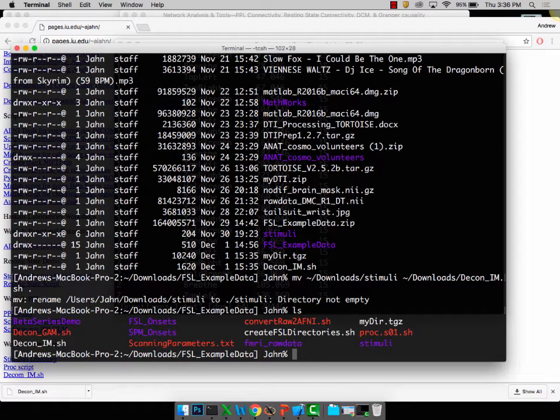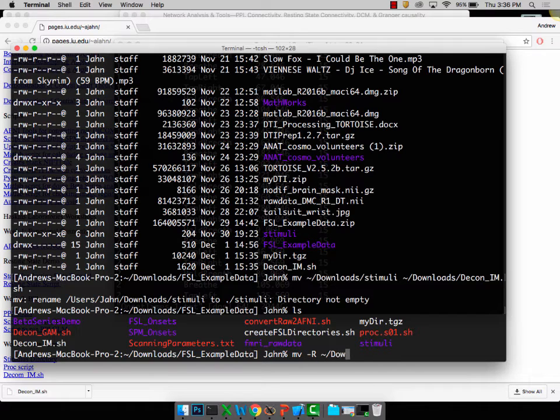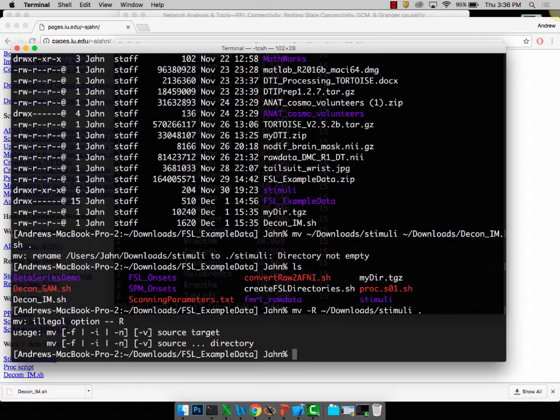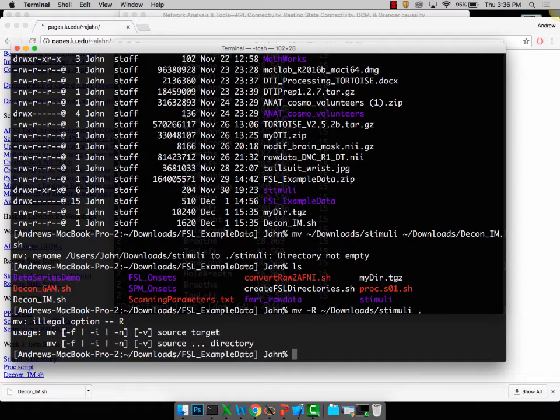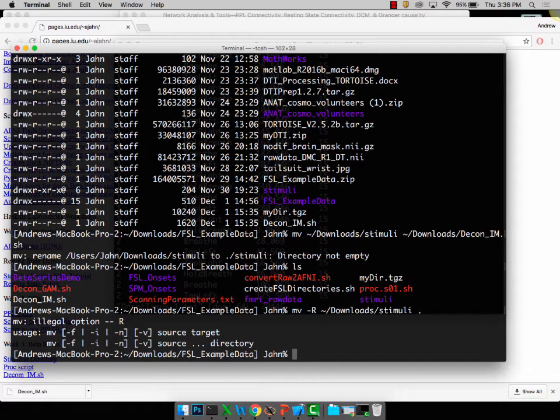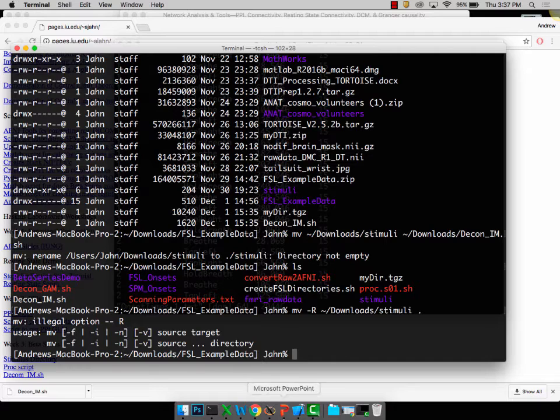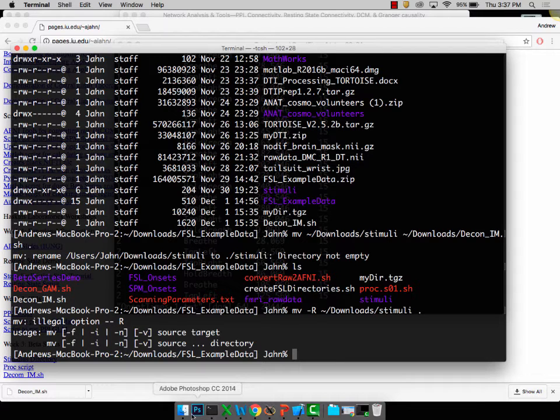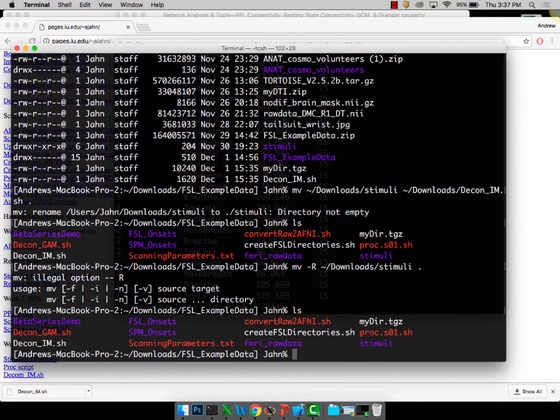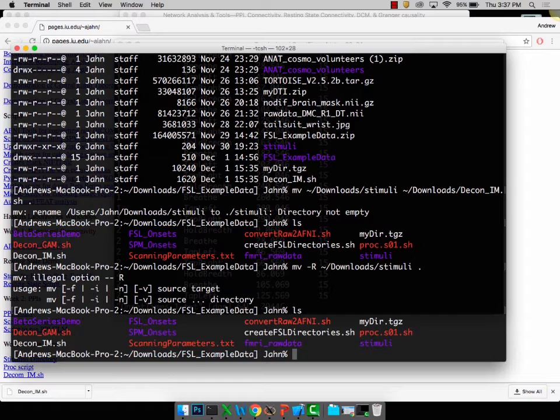If you want to know what you just downloaded most recently, there's a really useful command ls dash lrt, which gives you everything in reverse chronological order. Move the stimuli folder and also dcon underscore im to wherever your FSL example data folder is. You can use Finder if you need to.